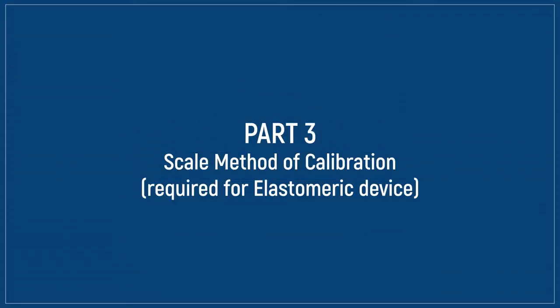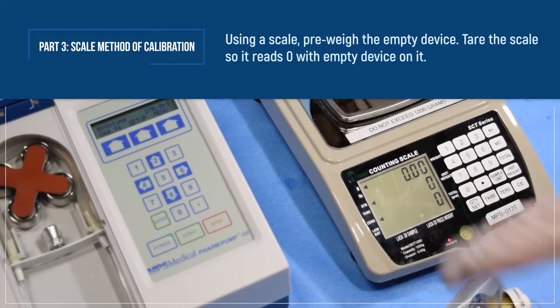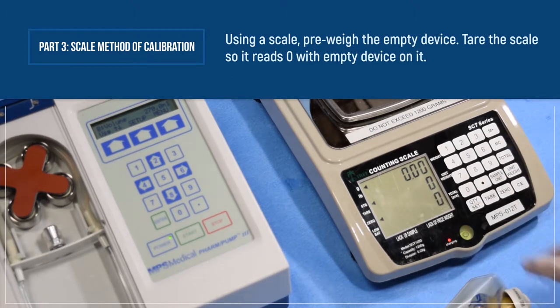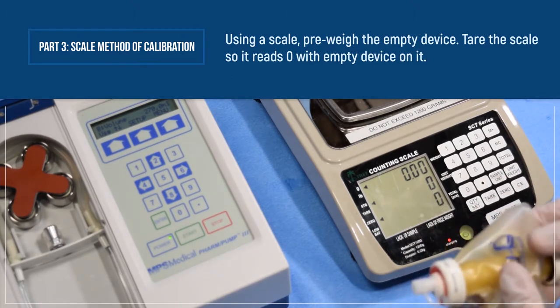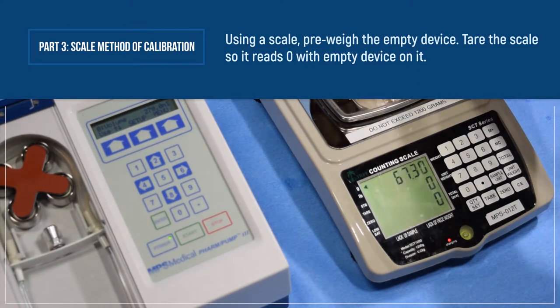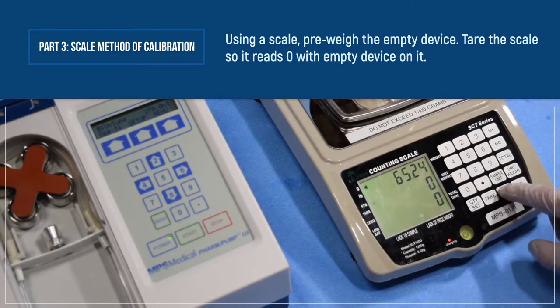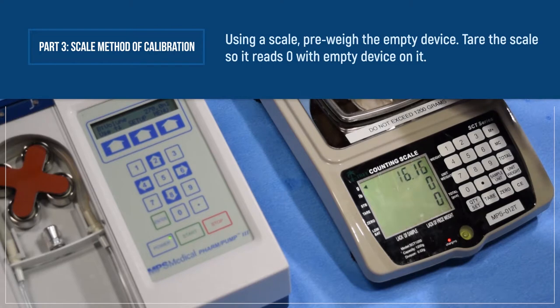Part 3, Scale Method of Calibration. Required for elastomeric device filling. Press zero when the device is on the scale and negative when the device is removed.